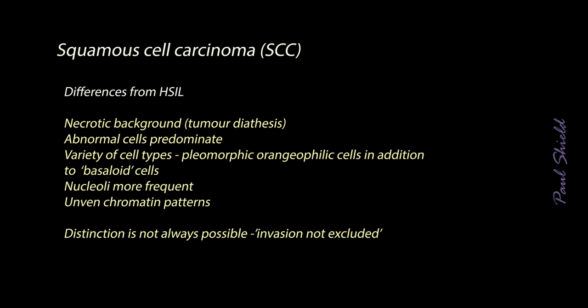And all of this varies from case to case. Sometimes it's quite an easy malignant diagnosis. Sometimes it's not really possible. And in those cases that are kind of grey area in between, we will often report high-grade cell with invasion not excluded, so that the patient can be seen perhaps more rapidly, but it conveys, I guess, some doubt on our part as to whether it's invasive.